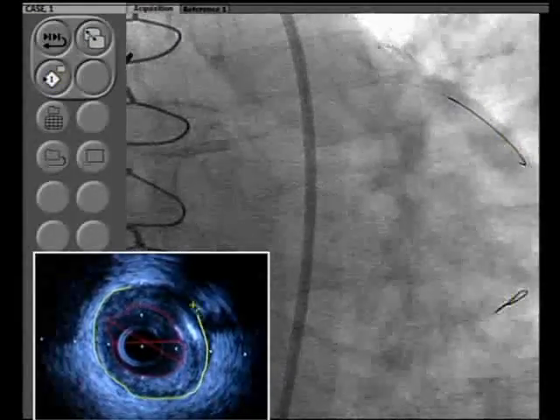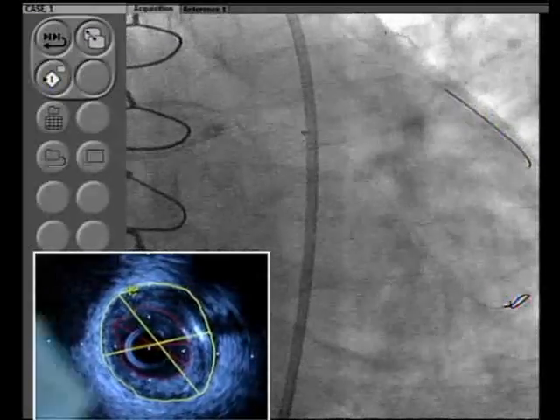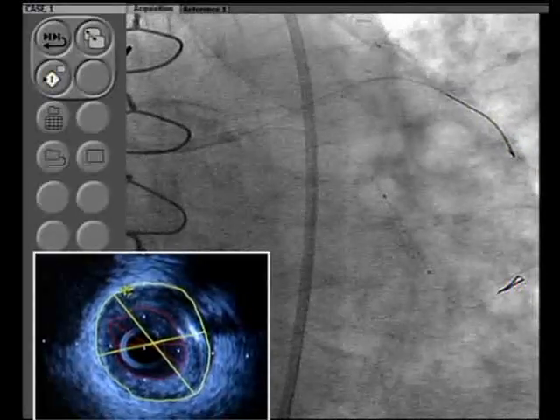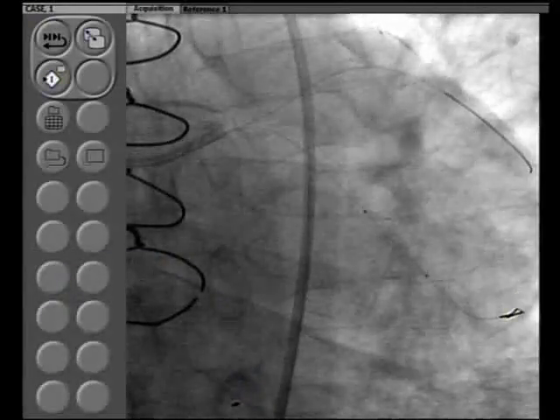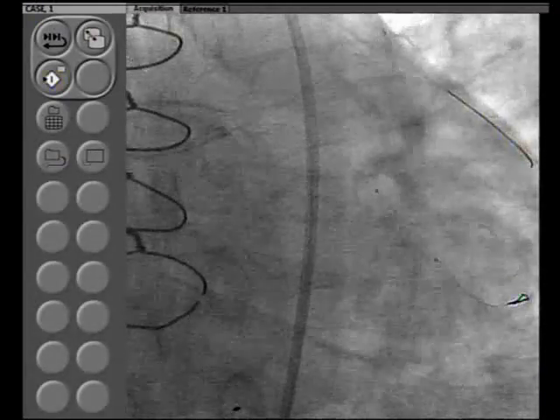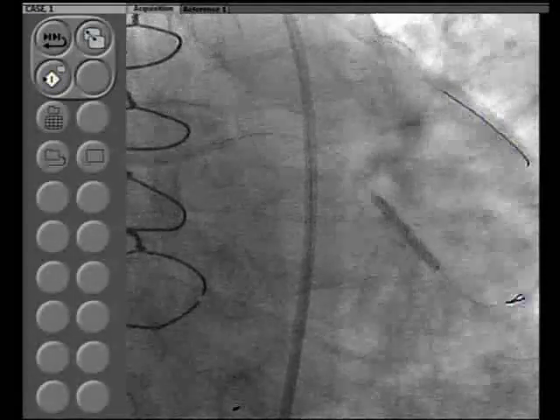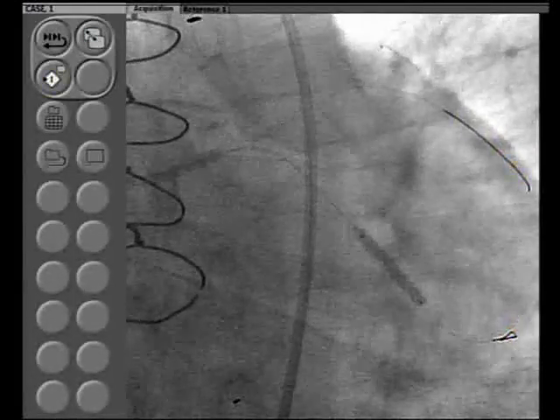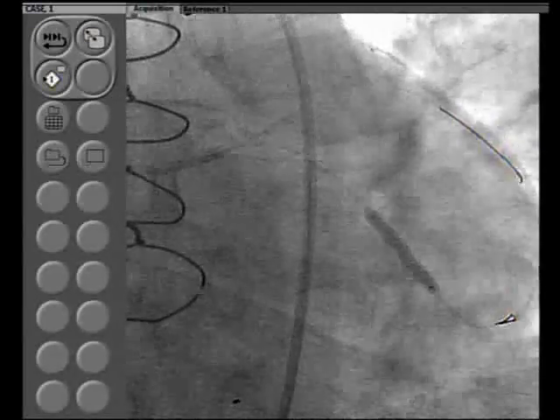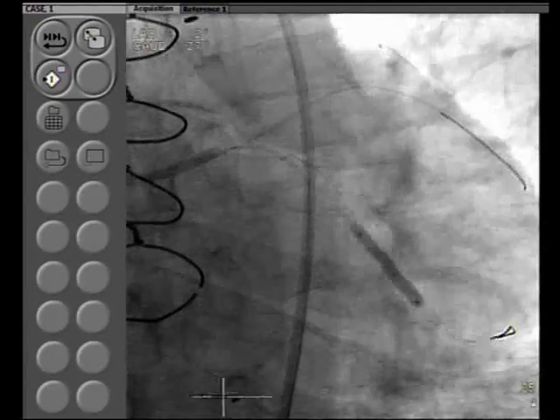And this actually will be part of the new imaging modalities like infrared spectroscopy: these lesions, many times at the corner of the edges, the presence of plaque at the edge where your stent lands will be associated with, or could be associated with, a higher stent thrombosis. Of course, there is some issue in terms of restenosis. Now it's a 3.0, 20 NC Voyager at 20 atmospheres.